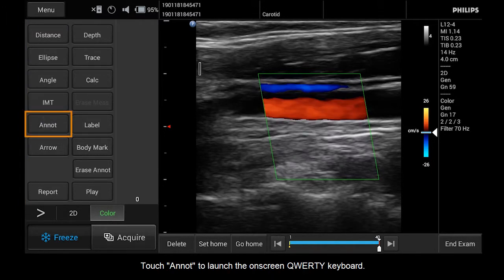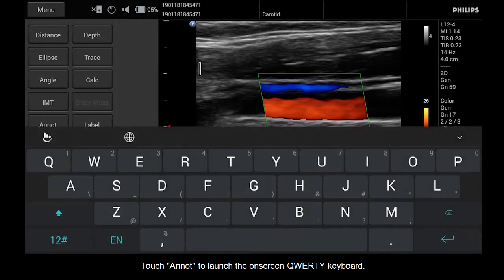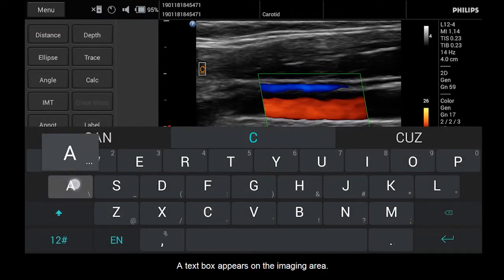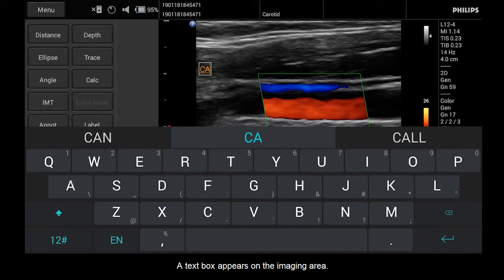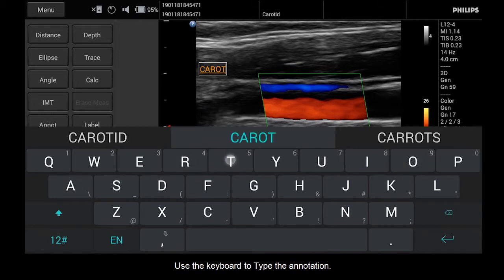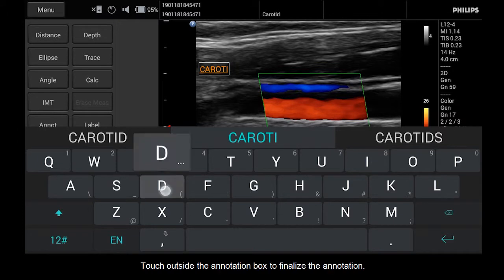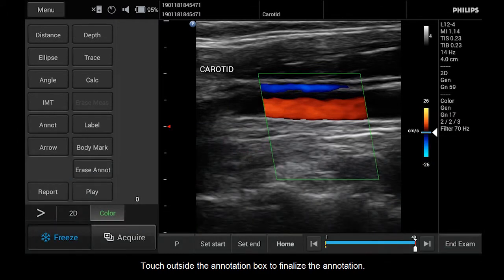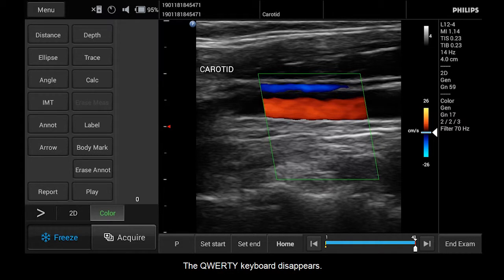Touch ANNOT to launch the on-screen QWERTY keyboard. A text box appears on the imaging area. Use the keyboard to type the annotation. Touch outside the annotation box to finalize the annotation. The QWERTY keyboard disappears.